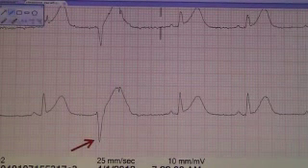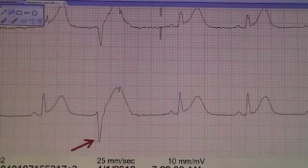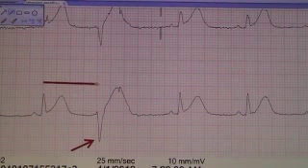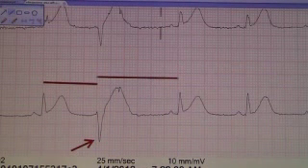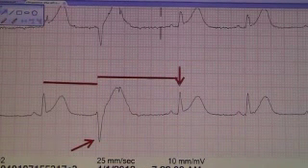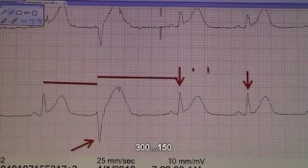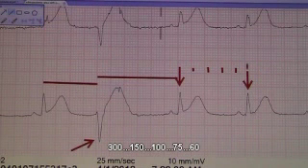One word of caution. An EKG strip that presents an irregularity in its rhythm, like the PVC that we have demonstrated here, will give you problems with this technique if you don't pick the right R to R interval. For example, you'll want to avoid the R to R intervals that involve the ectopic beat, the one either before or after the PVC. Instead, identify those complexes that belong to the underlying regular sinus rhythm. And when you do that, you can use the R to R technique to find 300, 150, 100, 75, and 60 as this patient's heart rate.